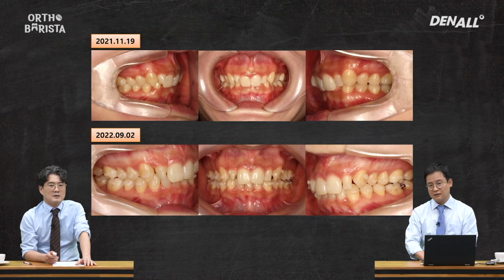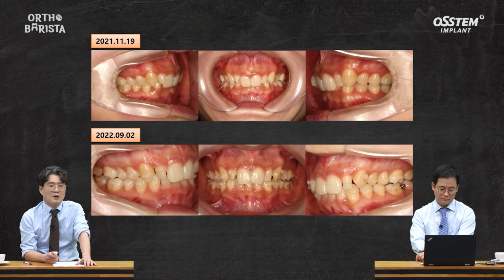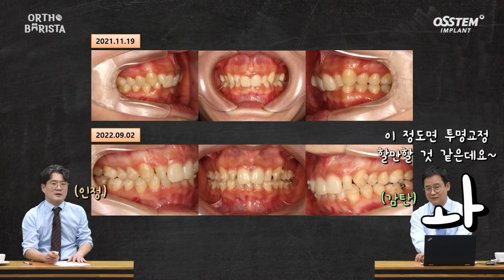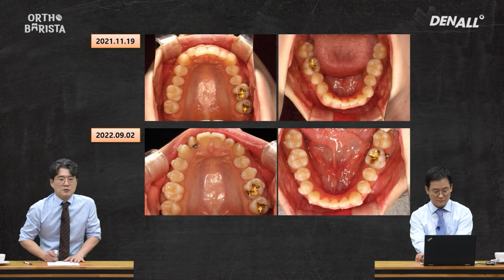So, as you mentioned earlier, on the maxillary and mandibular anterior region, we did tooth axis proclination, and after the change from class 2 key to class 1 key, followed by rotation control and so on. About the overjet and overbite, the status now seems quite good, doesn't it? Wow, this shows clear aligners really work. Yes, it looks good. You can see the proclination of the maxillary anterior teeth in the occlusal surface.